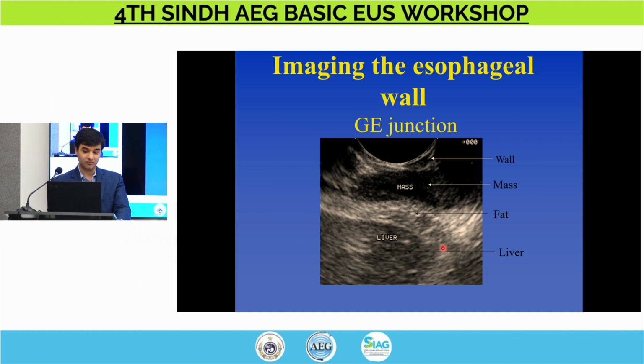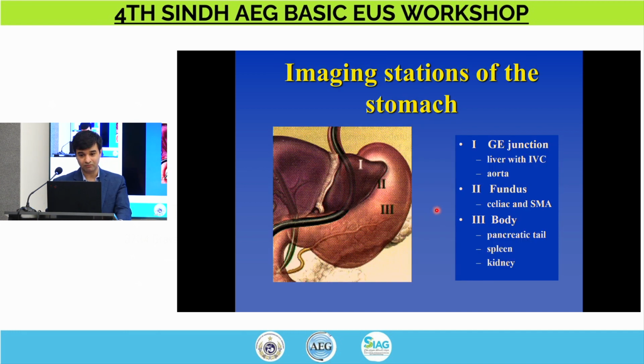So the question is, is this involving a structure that's adjacent to the GI lumen, or is it not? Because that would be crucially important. Yeah, so yes, it looks like this dark area is extending down here, and then somehow this white, nice differentiating plane gets very fuzzy, and you see dark going all the way through. Now these are older images. The newer imaging that you'll see is much more refined, but the concept is about the same.